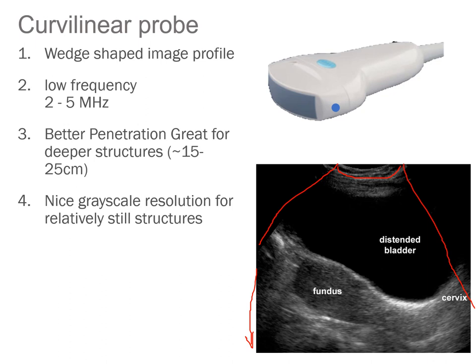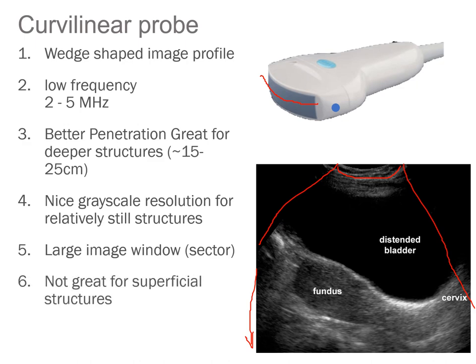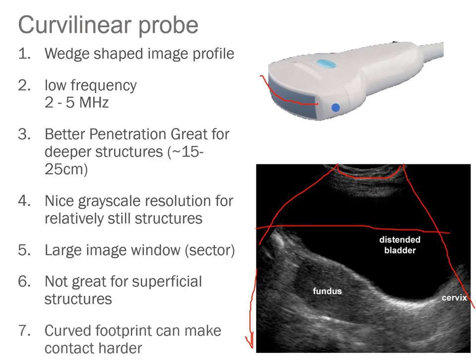So if you're scanning a liver or a gallbladder or a kidney, they're not moving very much. So you can have better grayscale resolution. But if you're scanning a heart, this may not be the probe with the presets that you'd want to start with. It does give you a nice large window because of that very large footprint that it has across it. But it's not going to be great for superficial structures because there's not great resolution in the near field. And as you get further away, the lines of sound start to deviate, so you get even further resolution degradation.